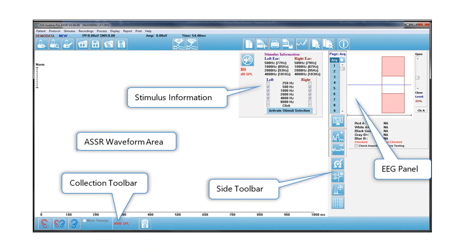The bottom of the window is what we call the collection toolbar, and that's where you can start a test, stop a test, change the intensity, etc.